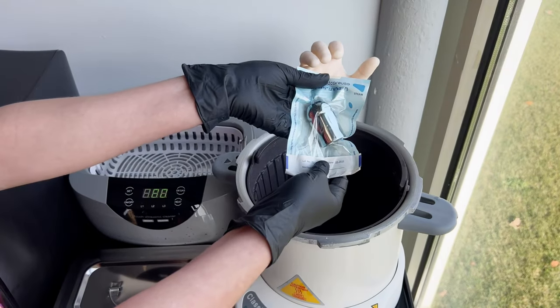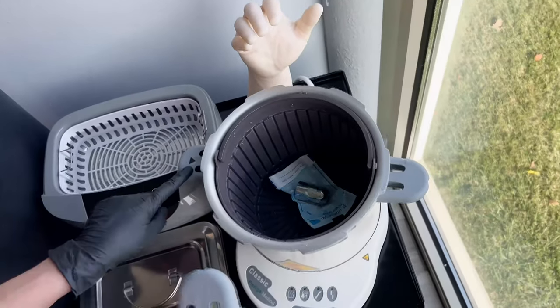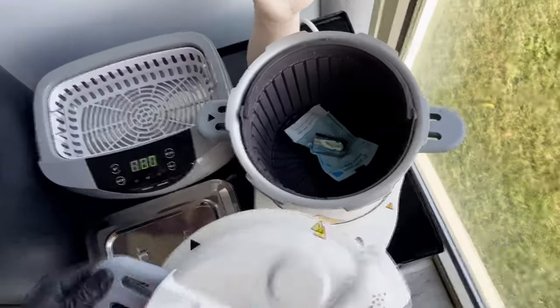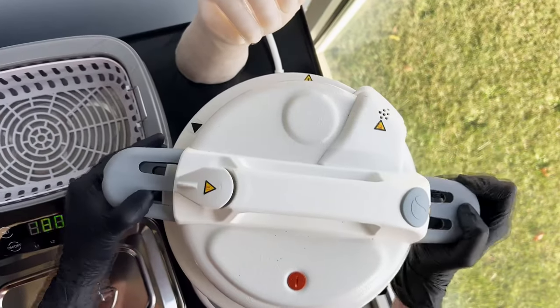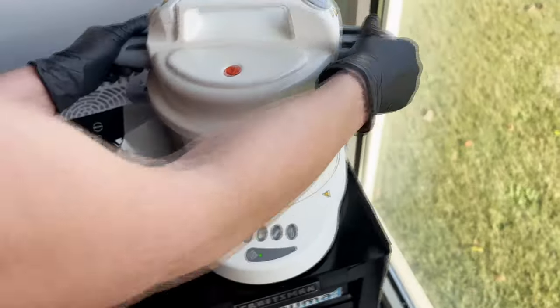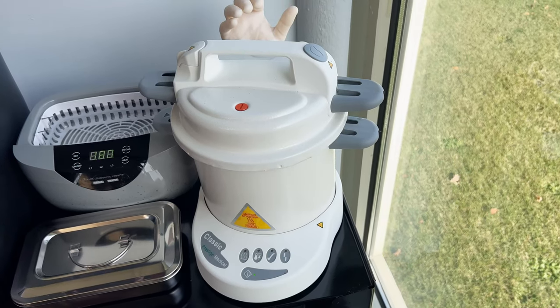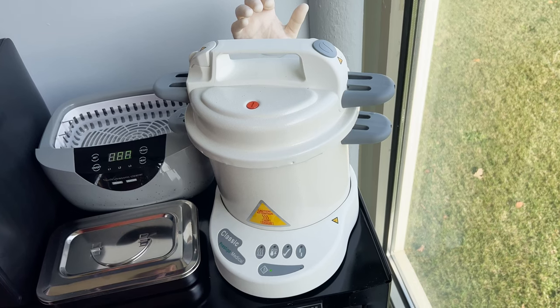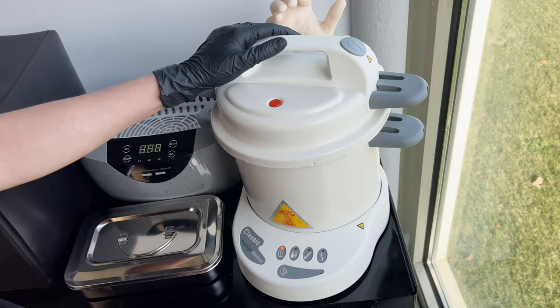I'm going to fill up my autoclave to that line with distilled water — more or less at that line. I'm going to return my baskets and put in my grip. Remember this is like a giant crock pot, so you want to make sure it's sealed properly. You'll see arrows at the top — match those up and turn the handles so everything aligns linearly. Give it a little tug just to make sure it's all secure.